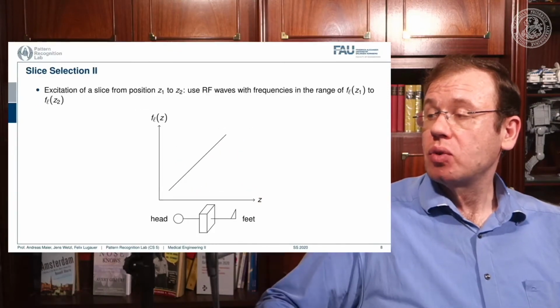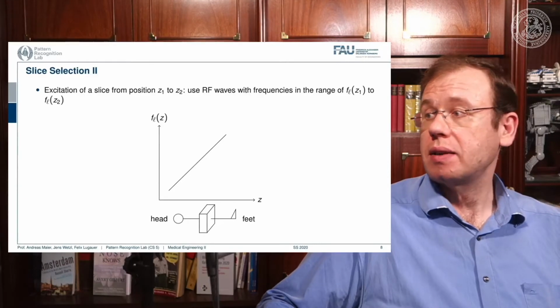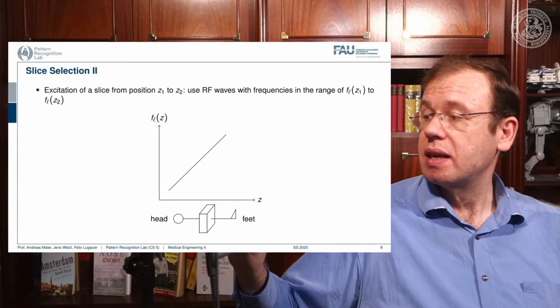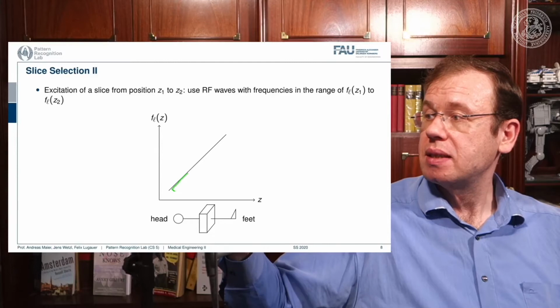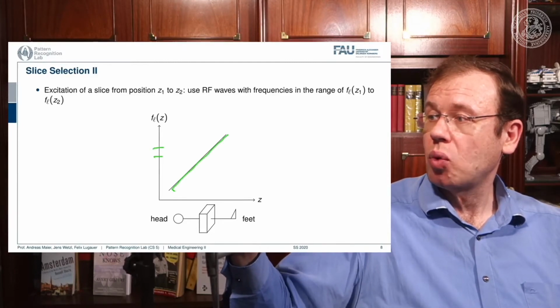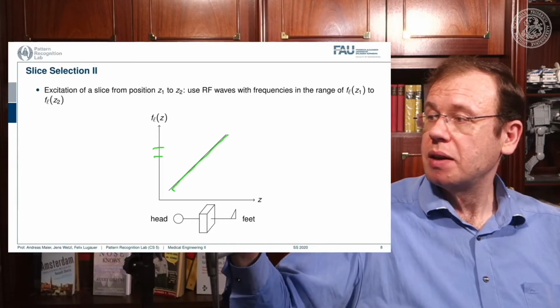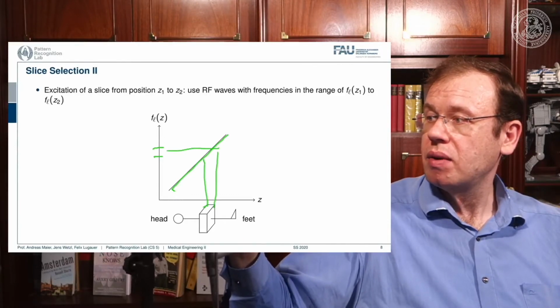So how would we do this? Well, we would pre-compute at what frequency we actually have to excite. Then we apply a specific gradient, and of course we do that with the right steepness. And we know that maybe we are exciting a little more because there's some co-excitation of neighboring frequencies, but we can then map this very nicely to a specific area within the body.